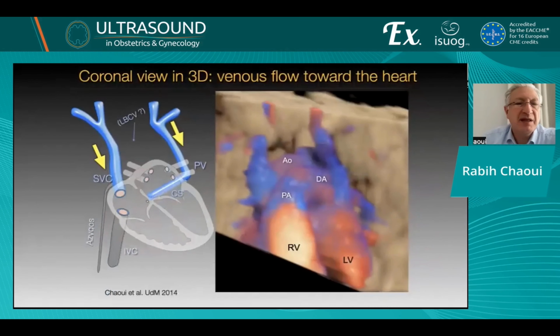And you see here on 3D, you can also demonstrate the flow from the neck toward the heart, both on the superior vena cava and on the left superior vena cava.